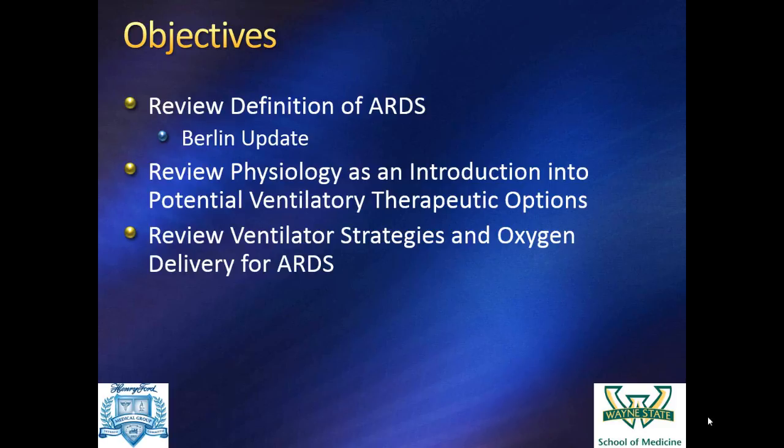It's also acknowledged that APRV was designed for a population of patients that don't have normal lungs, and those patients make sense because of that. Just to that point, there are positive studies about recruitment maneuvers and higher PEEPs for patients with normal lungs in the perioperative period. It's a very different population than what we're talking about.